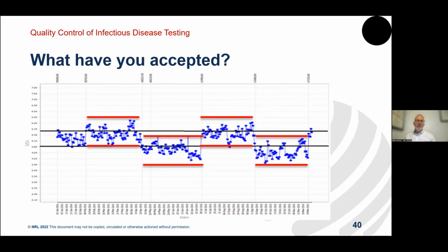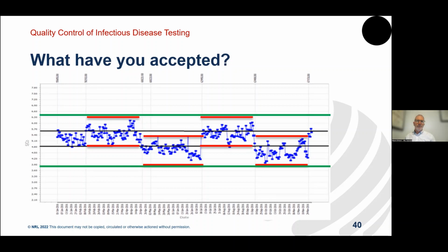When it's the acceptance criteria that we're using, that is the likely reason why we're observing issues with variation. It's typically because we're re-establishing those acceptance criteria. And what happens if you re-establish acceptance criteria by reagent lot is that we're normalizing the bias we're seeing. We're expanding that range based on observed bias rather than using a meaningful way of calculating what that range should be in the first place.